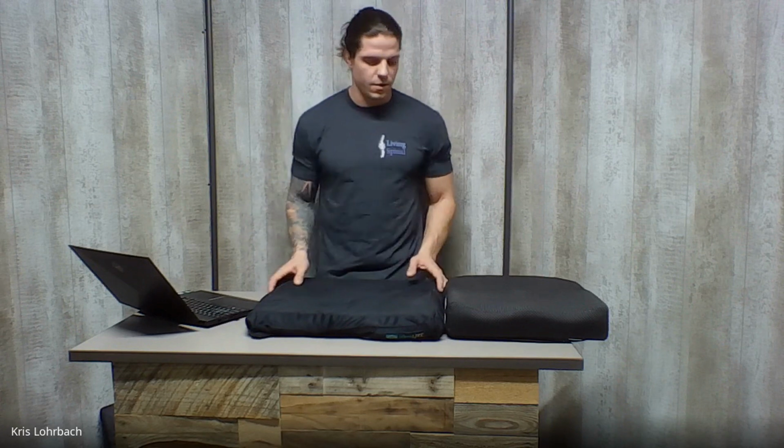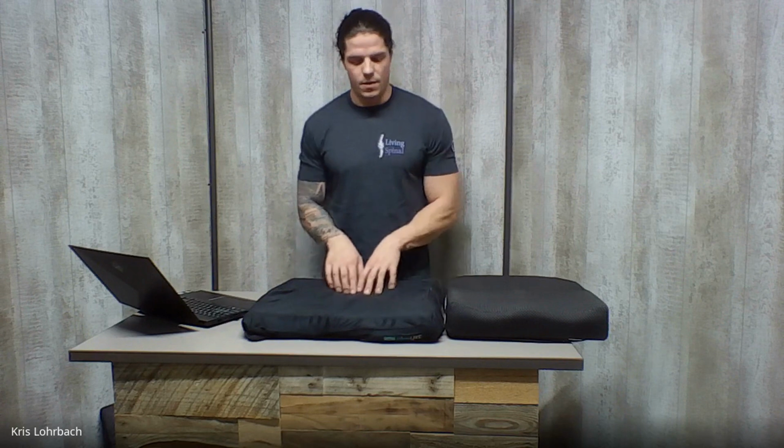So if you're talking to them, it's a good thing to say, well, how tall is your current cushion? And if they say 2 inches, you know that they probably have a mid-profile cushion. And if you guys are looking at a high-profile cushion, just tell them, hey, because we're going a little taller, you might fit in your wheelchair a little bit differently. And you can also just tell them, if they have a high degree of disability and it seems like it may affect them a lot, you can say, well, maybe it's best to talk to your physical therapist.